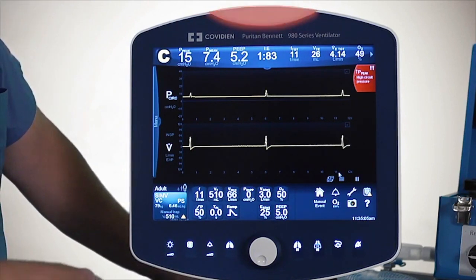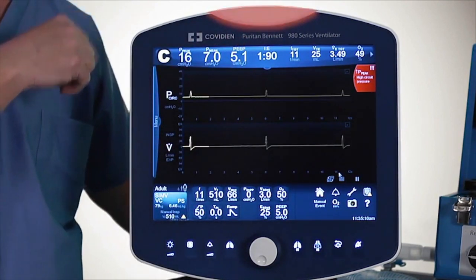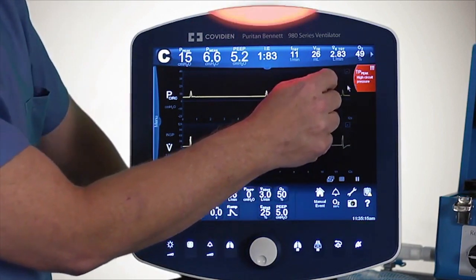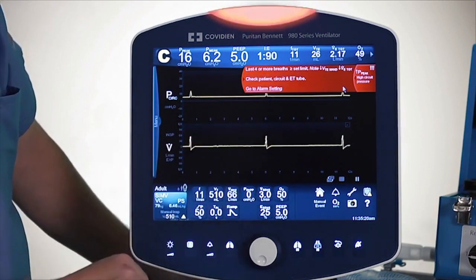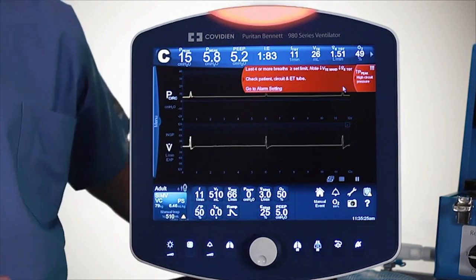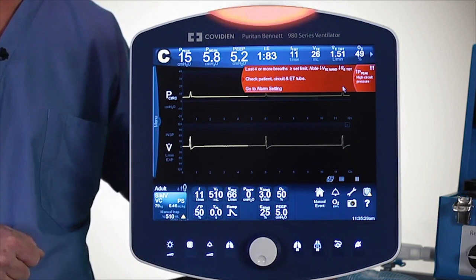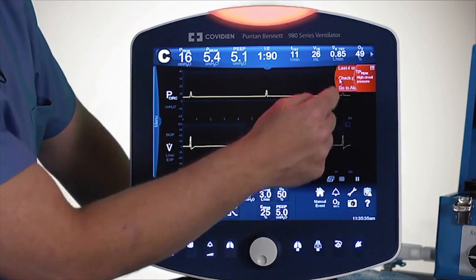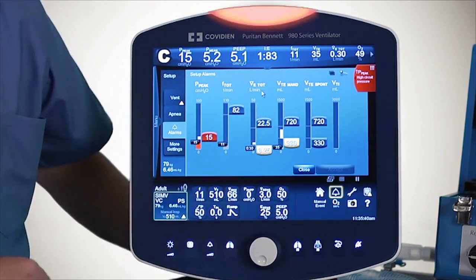As we see the alarms, a couple of things happen: we see the alarm displayed over here and on top. I'll pull out this banner — it tells me the last four or more breaths have exceeded the limit, tells me to check the patient, gives some recommendations, and there's also a hot link right to the alarm setting screen. Pushing that hot link pulls up the alarm screen directly.